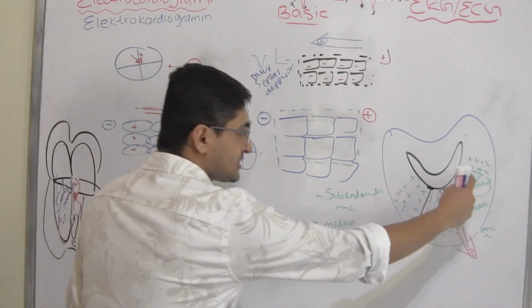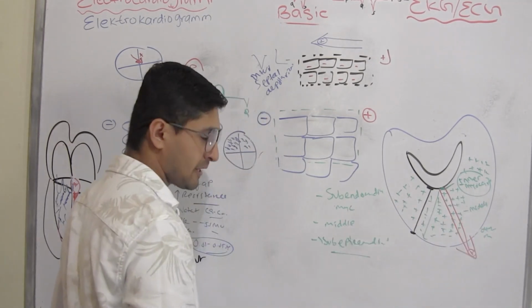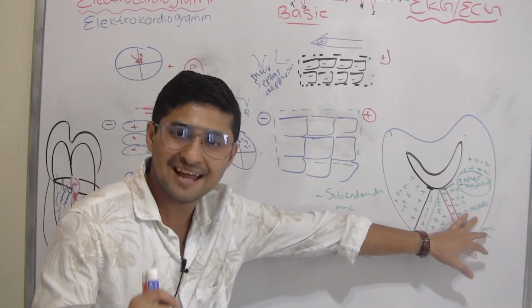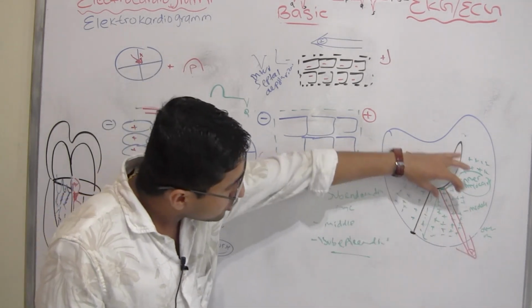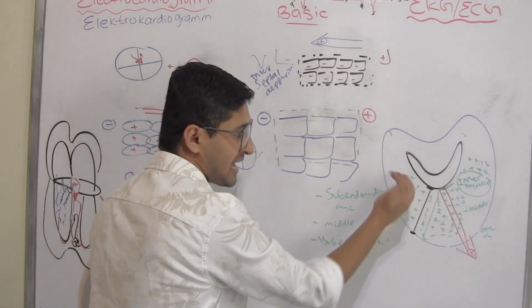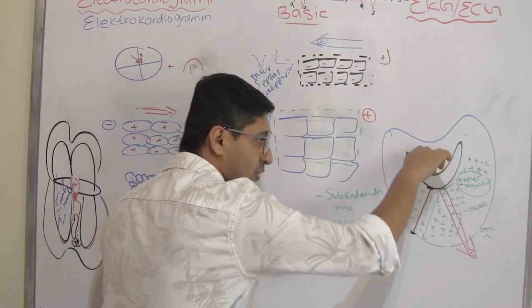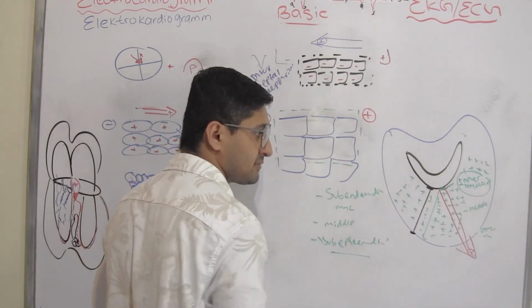Remember, this depolarization is happening in the ventricles, both right ventricle and left ventricle, okay? But remember, the left ventricle is thicker than the right ventricle. So because of the thickness of your left ventricle, that takes over these vector positions. Because of that, we say the depolarization, or the electrical wave, the current is actually moving from in to out, so it's going downward towards the left because of the thickness of the ventricular myocardium cells.